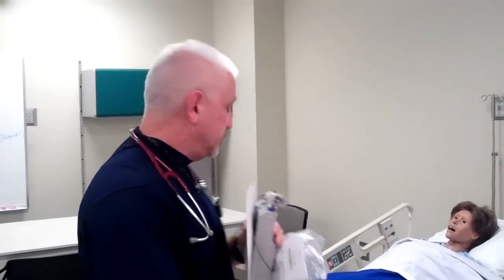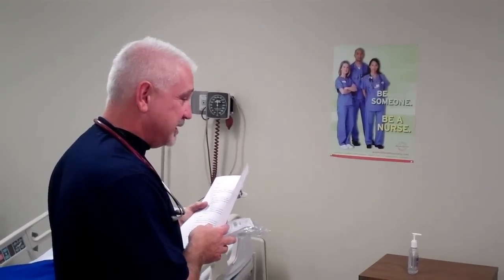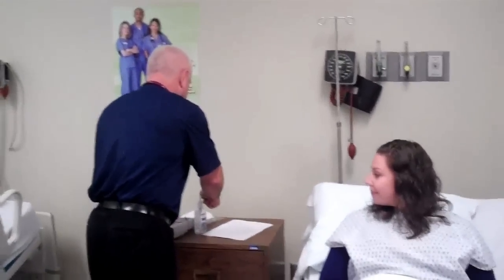I'd go into the room and say: 'Hi Ms. Hatch, my name is Alan, I'm from Respiratory, I'm here to put you on some oxygen. How are you feeling?' The patient responds: 'I feel okay, I'm just a little short of breath.' I'd ask how long she's been feeling short of breath, and she says probably the last 24 hours. I'd advise her to let the nurse know sooner in the future so Respiratory can come and place her on oxygen.